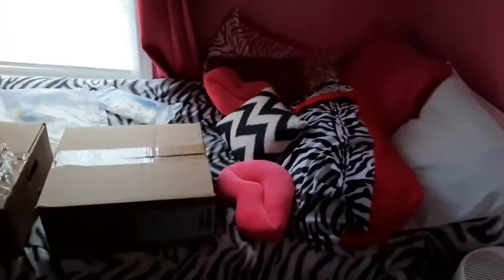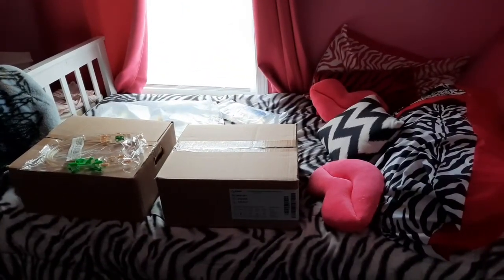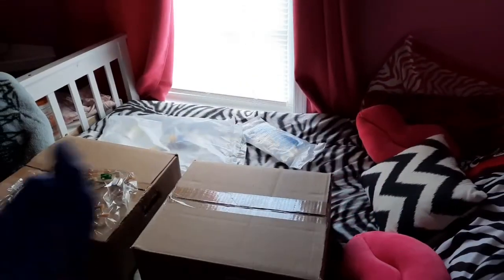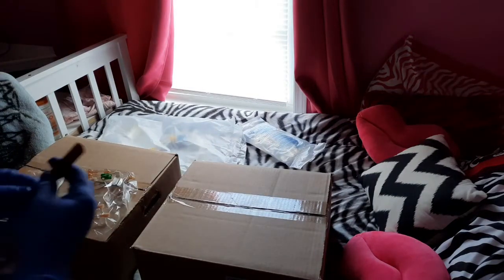You have to wash your hands, then use the hand sanitizer, which I've done, and put on your gloves. Everything must be kept as sanitary as possible, okay? So I'll be back. Let me put my gloves on. Okay, gloves on. Well, my sleeves, I should say.